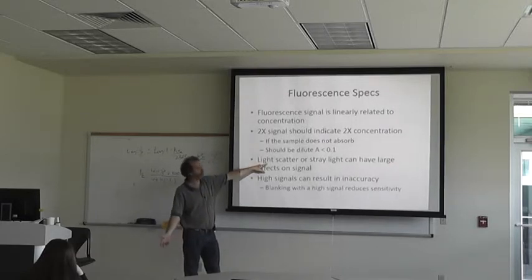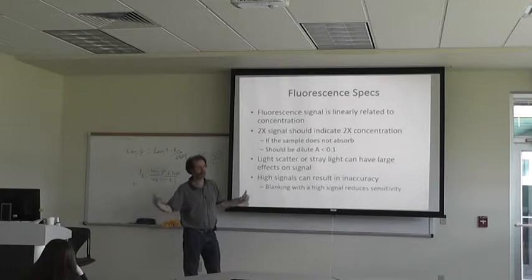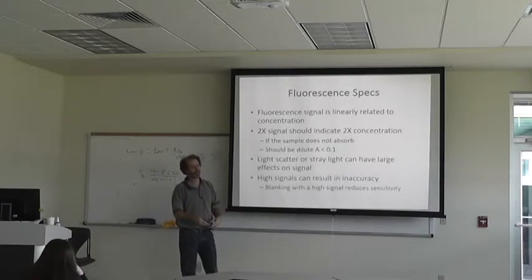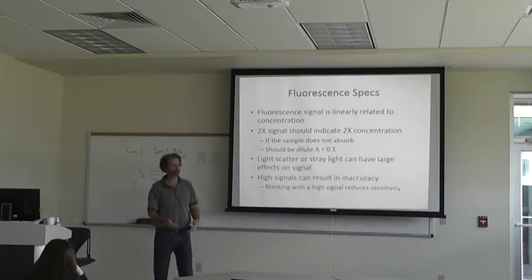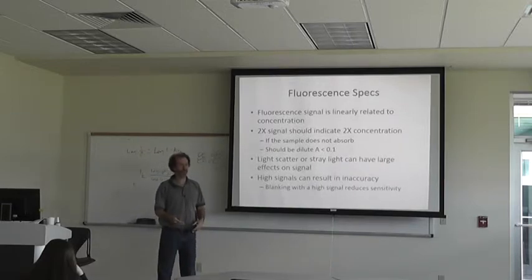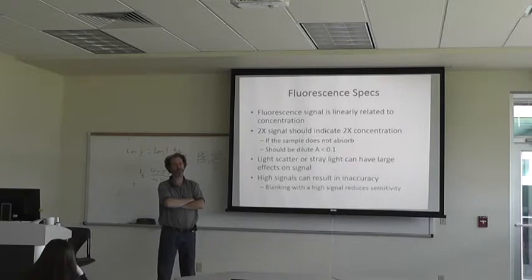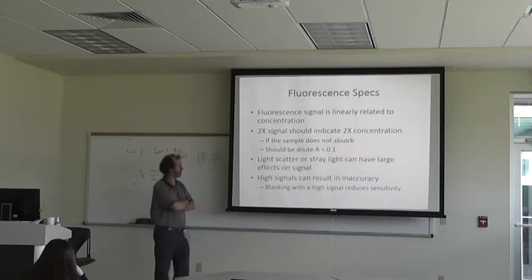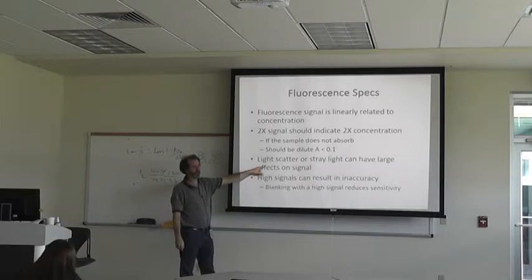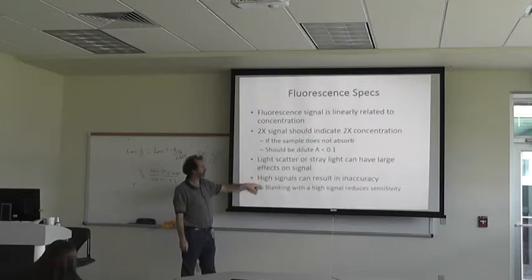Light scatter or stray light can have large effects on the signal. Stray light coming in will make an apparent increase in signal, same thing with light scatter. What causes light scatter common in samples? Turbidity, which comes from lipids — VLDLs and chylomicrons. High signals can result in accuracy issues too, and if you blank with a high signal it's going to reduce the sensitivity.